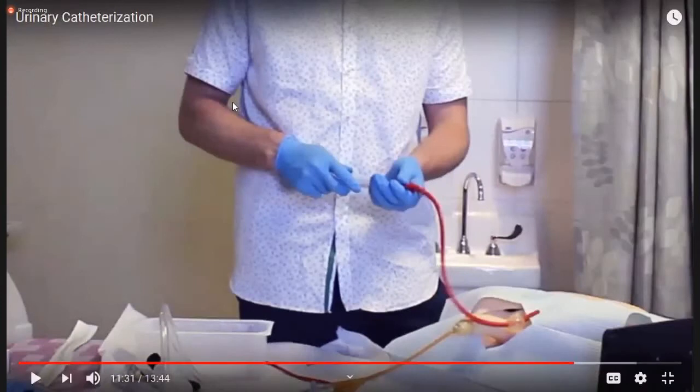Before inserting the tube, you will check the balloon patency.